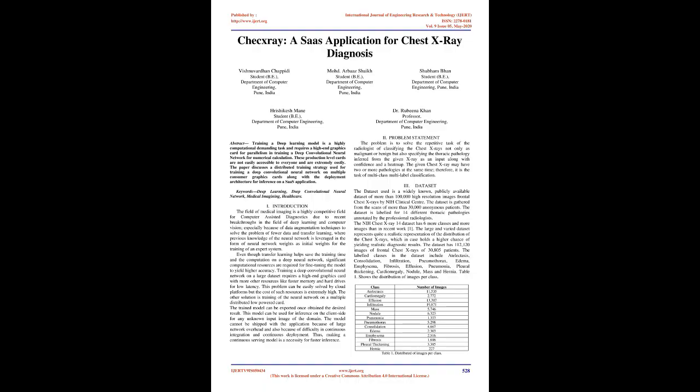CheXray, a SaaS application for chest X-ray diagnosis. Abstract: Training a deep learning model is a highly computationally demanding task and requires a high-end graphics card for parallelism in training a deep convolutional neural network for numerical calculation. These production-level cards are not easily accessible to everyone and are extremely costly.